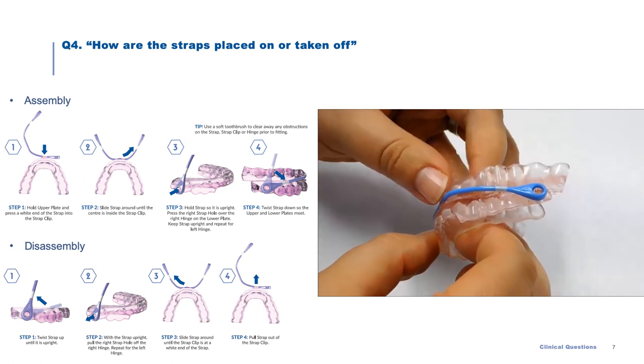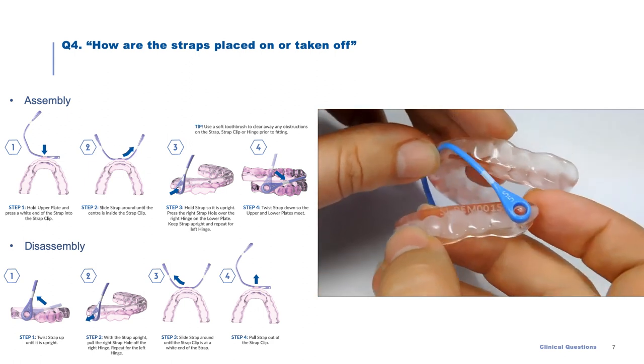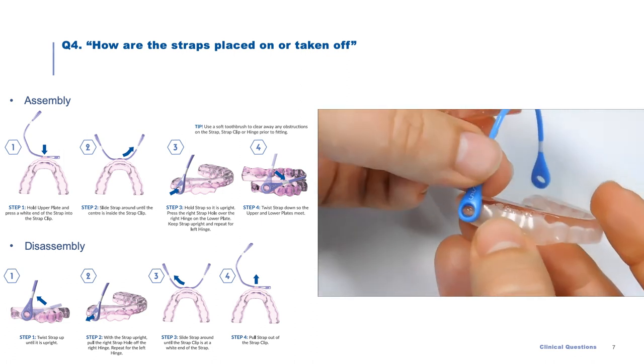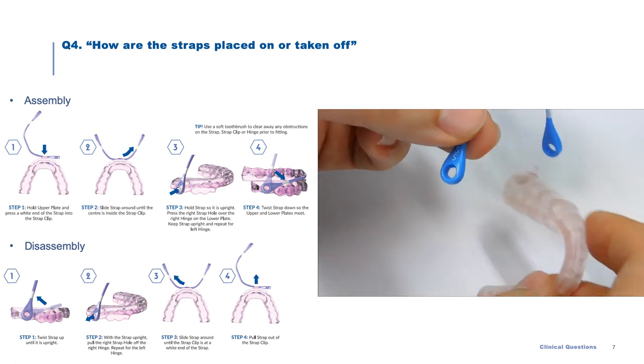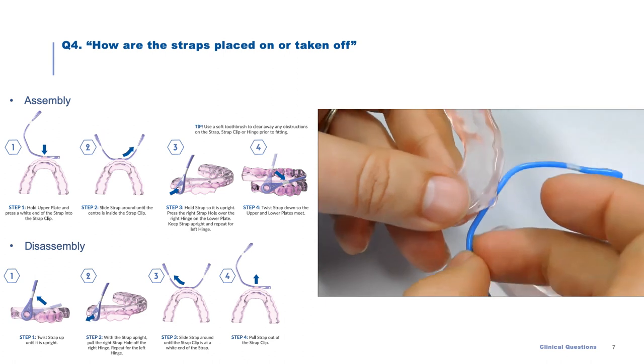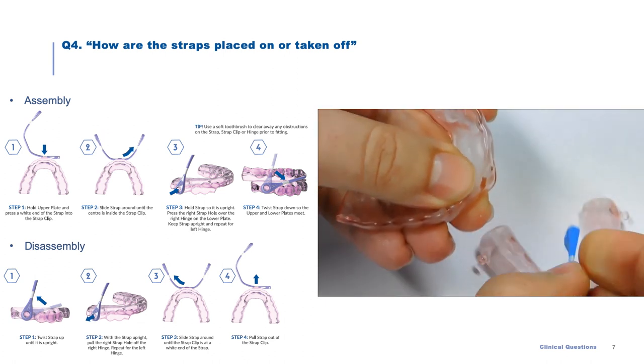Rotate the strap down so the plates meet. To remove a strap, rotate the strap until it is upright. With the strap upright, pull it off the right hinge. Repeat for left hinge. Slide strap around until strap clip is at the white marking on the strap. Pull the strap out of the strap clip.